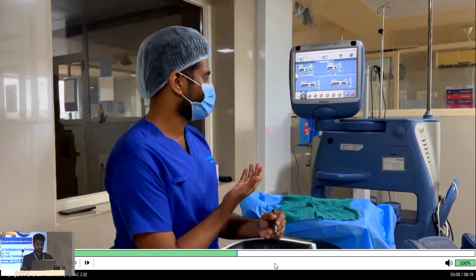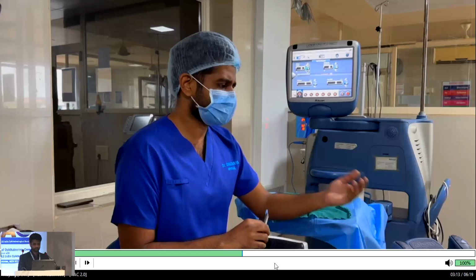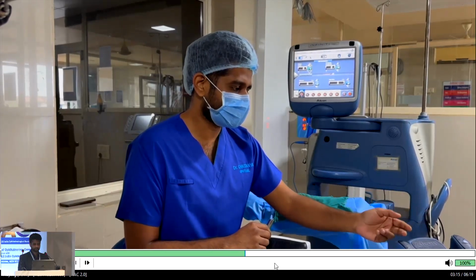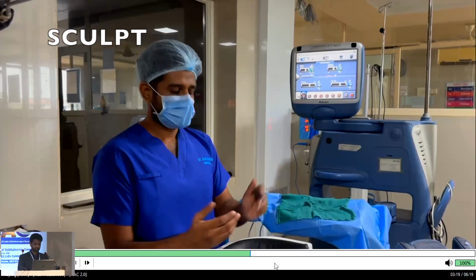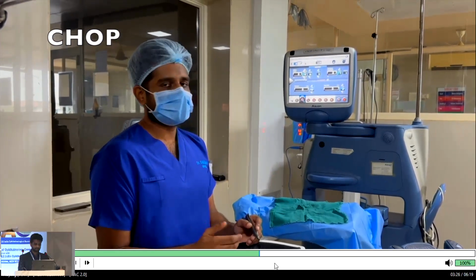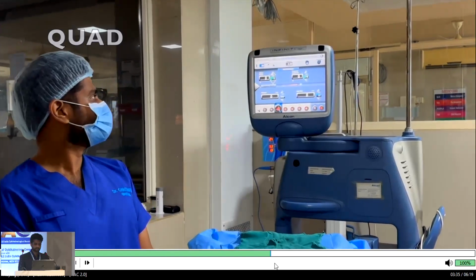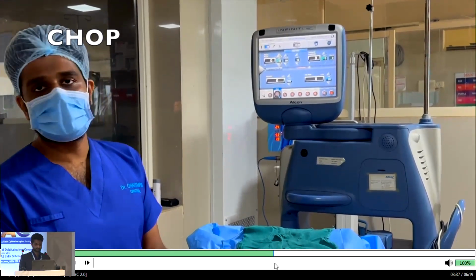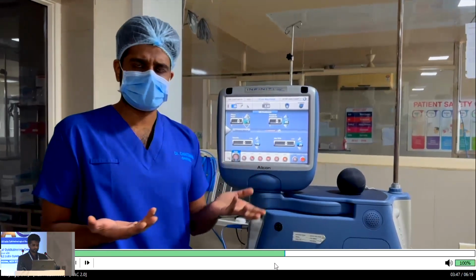While you are doing the surgery, if you want to control your phaco machine parameters, or your foot pedal switches fail over time, you can always customize with voice commands. Alexa, previous mode. Okay.